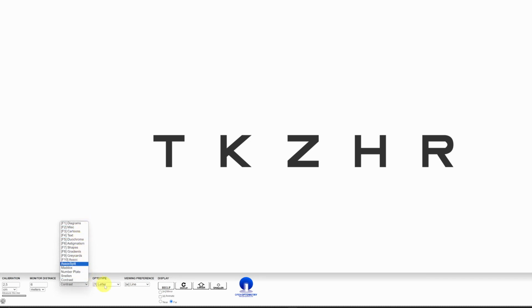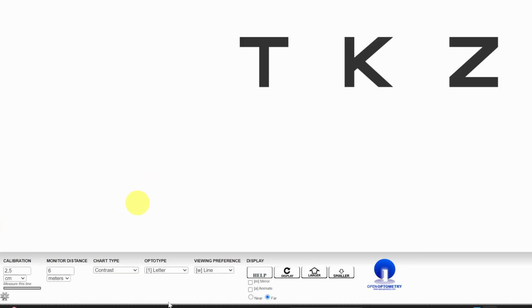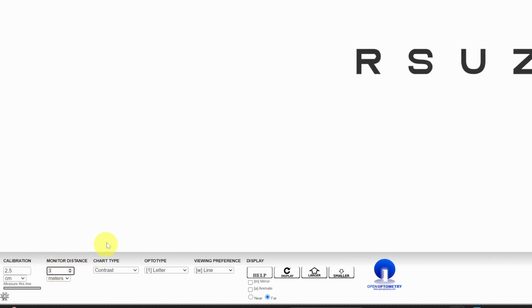Just plug it in. It's got the options to mirror. So if you are looking in a mirror, you can just set the mirror option to have it mirror. And I think the most important thing to know is just how to calibrate it correctly. So in the bottom corner here, you can see some numbers. There's two things that you need to measure. The one is the distance in meters that your patient is standing from your chart. So if it's 3 meters, let me just put 3 in there. You'll see that the numbers get smaller, obviously.